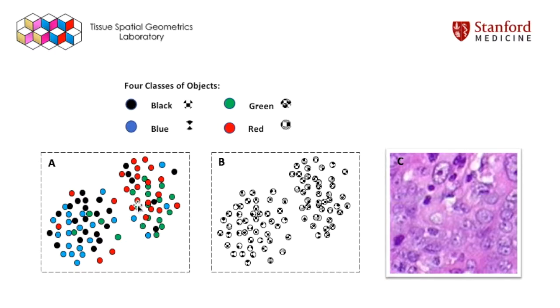But if you were to change the color scheme from solid colors into these distinct checkered patterns, what you get is the image in panel B. The image in panel B is the same as panel A, except we switched the solid colors for these recurring checkered patterns. And it's obvious that it's much more difficult to pick out which categories are hanging out together and which are far apart based on these checkered patterns, because again, the human eye is easily distracted by high levels of disorder. But this is the very challenge that a pathologist faces.